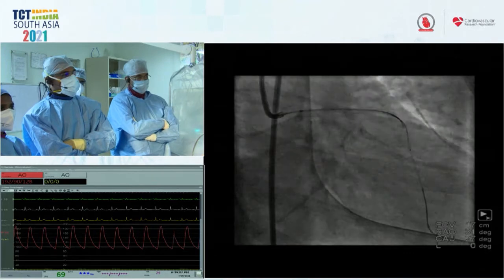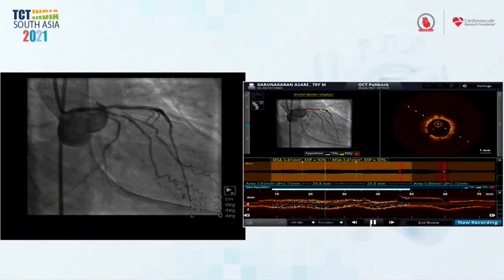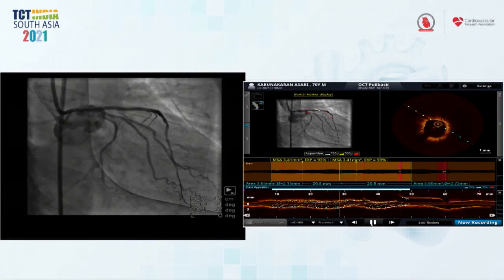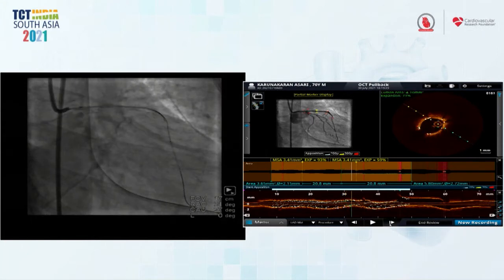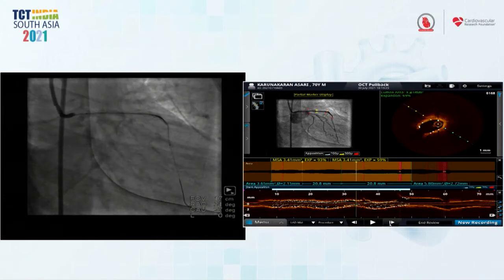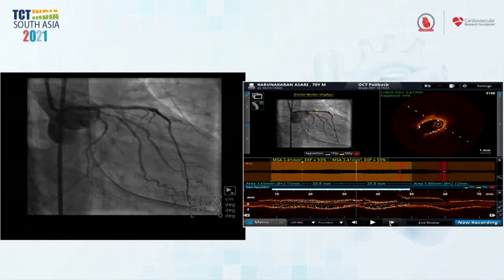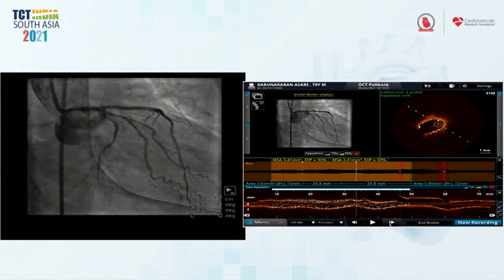Team, I had one question. The drug-eluting stent in the LAD was placed very recently, so there's probably drug still there, right, in terms of creating new injury in the area that was not expanded? The LAD stent was placed within the past month, did I get that correct? Yes, that's correct. It's about a month. It's an underexpanded stent. So there's still drug there, which is nice. That lessens concern that you would create a nidus for ISR with the balloon you're doing in the LAD, which is wonderful.